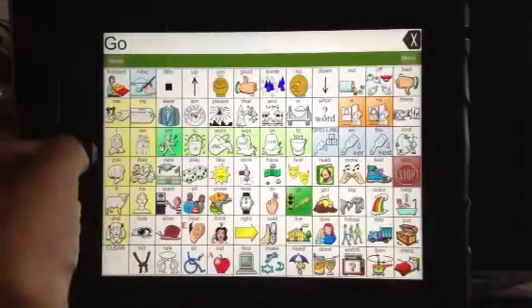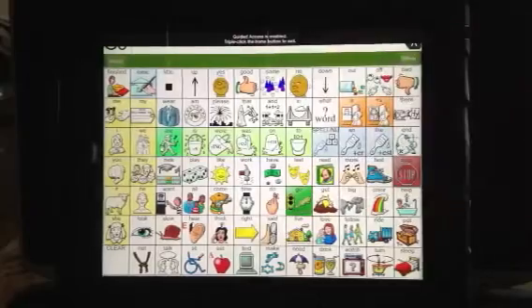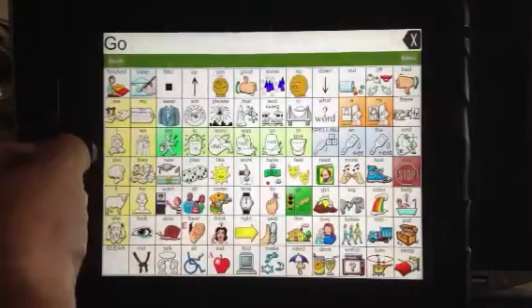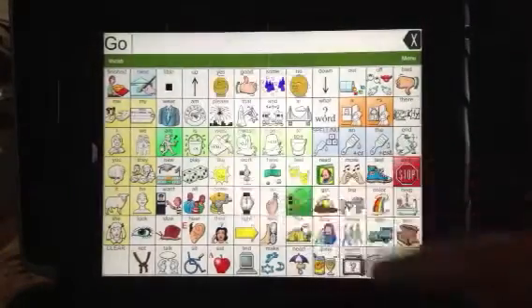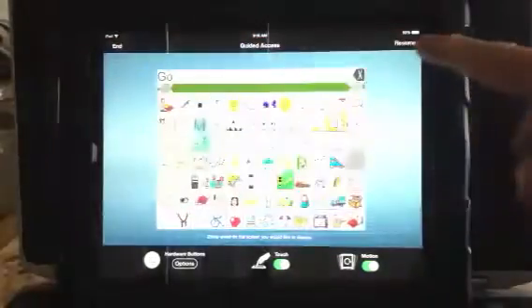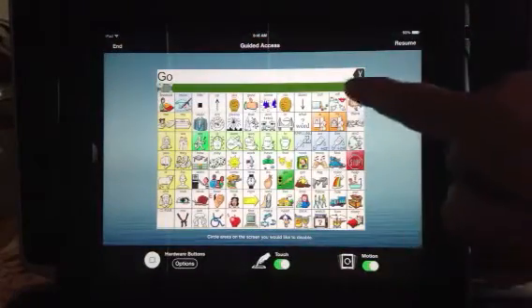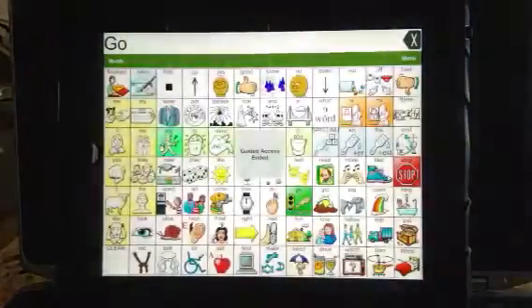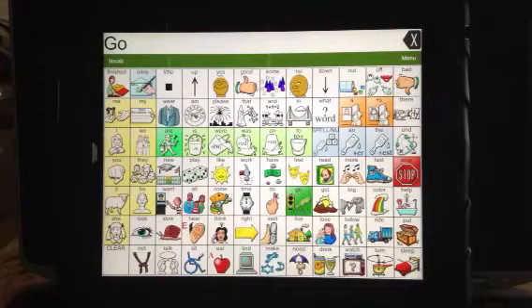Even the Home key doesn't work — when he tries to hit it, it says you have to triple-hit the button to turn off Guided Access. And remember, even when I hit it three times fast, I have to know the password to get out. Then here's where you say End — because if I hit Resume, I'm right back to where I started. So I'm going to tell the stop button to work again and then just say End. And that's how you set up Guided Access to keep a child in the LAMP Words for Life vocabulary.